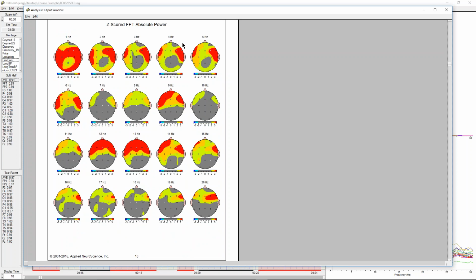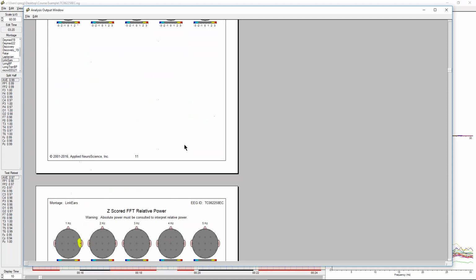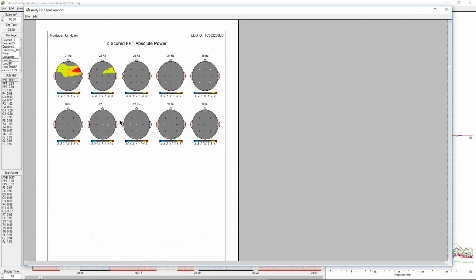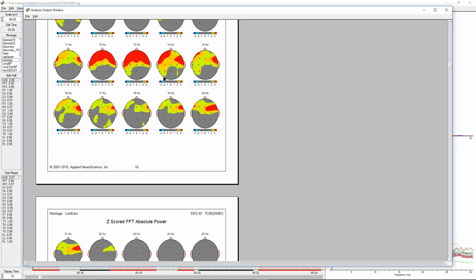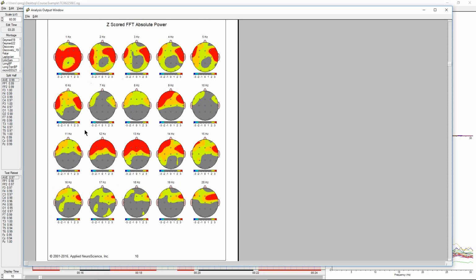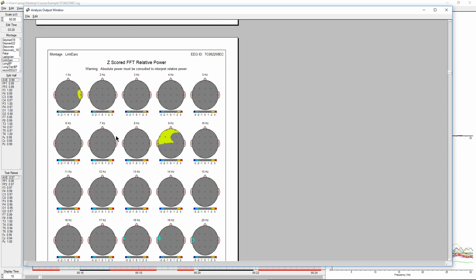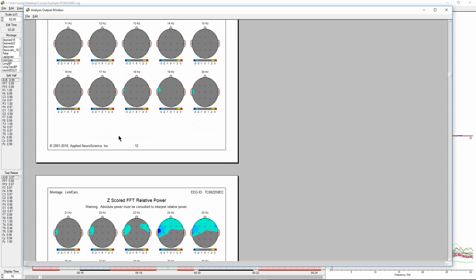She's got a lot of excess abnormal activity, especially in the slow frequencies, but also throughout up to the low beta frequencies and the regular beta frequencies, but not a lot of excess fast activity. So this isn't muscle tension related. Some of this activity may be related to that reference contamination problem that I mentioned.